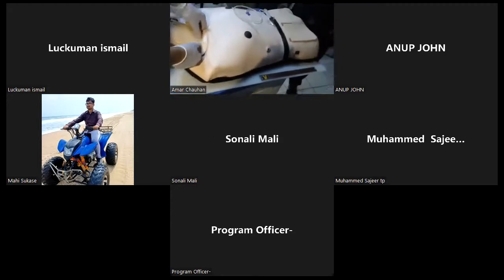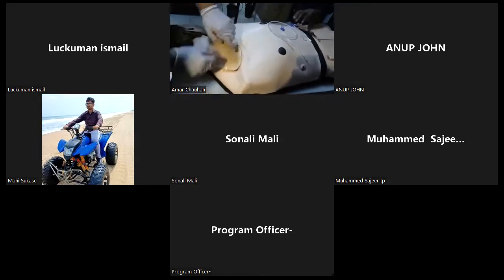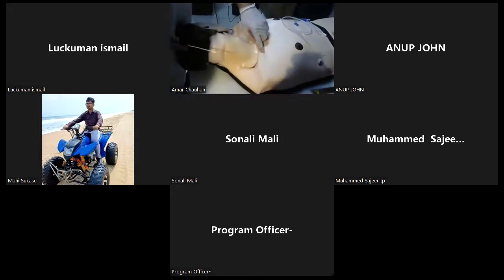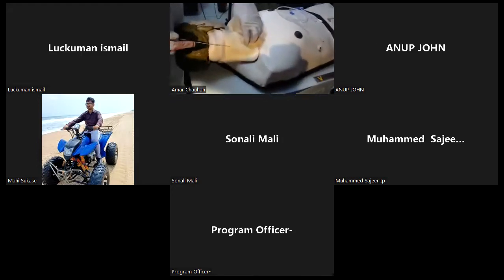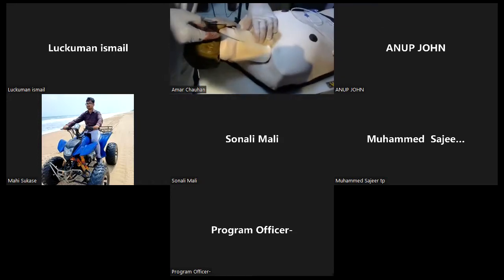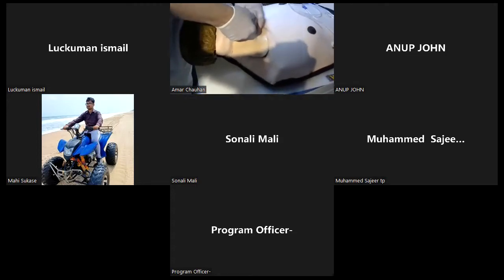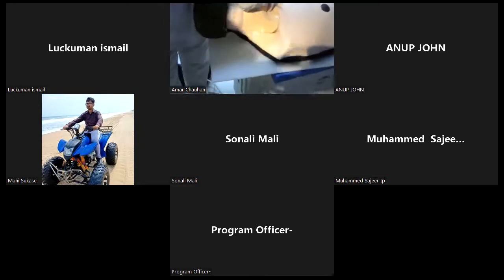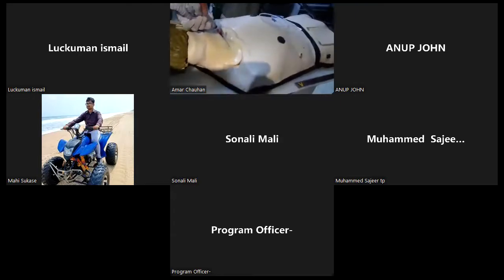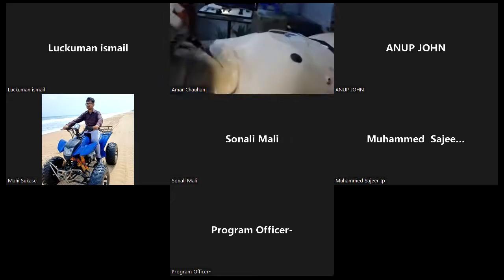Okay, internal jugular vein cannulation. This is the triangle formed by the two heads of the sternocleidomastoid, and the base is formed by the clavicle. So I will be going in the center of the triangle. You can also pursue other landmarks. Pin the carotid artery and go in the center of the triangle, aiming towards the ipsilateral nipple. Once you puncture the skin, hold the syringe, keep going, keep aspirating. When you aspirate blood, you stop there.